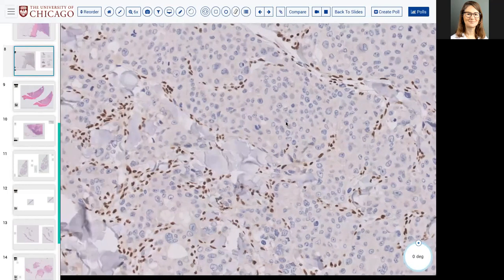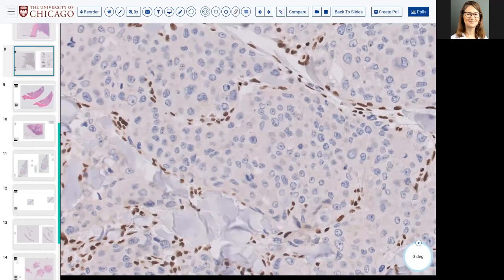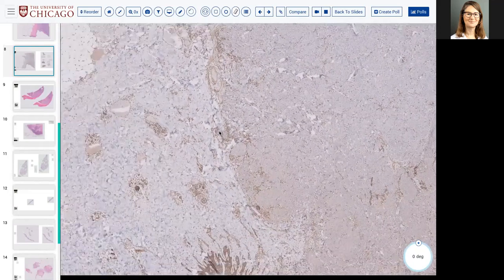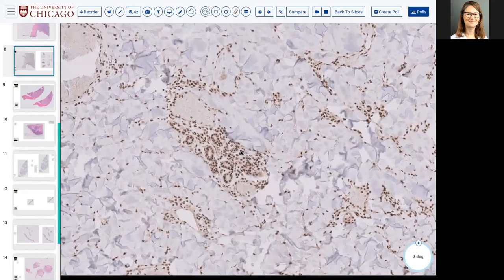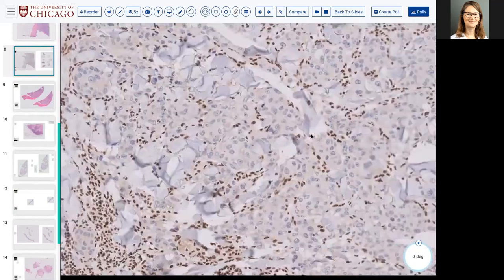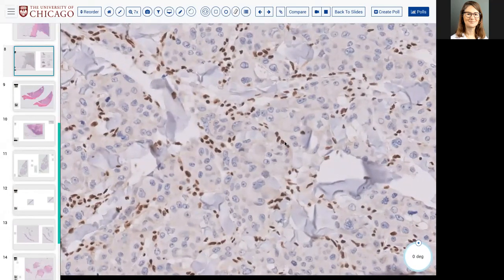If it's in a visceral organ like a lung, it's a carcinoma. And what that means for the patient, I don't know. But I would argue always check your internal control on these stains in which you are looking for loss, okay? Our lab tends to do a very good job with most immunostains, but we've seen cases on the outside that are misdiagnosed because they call the tumor lost, but there's no internal control, okay? And so that's not an accurate stain.